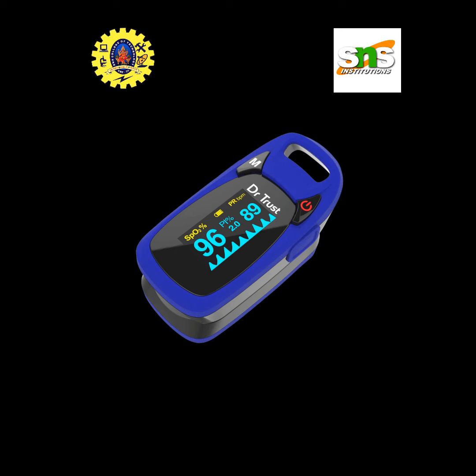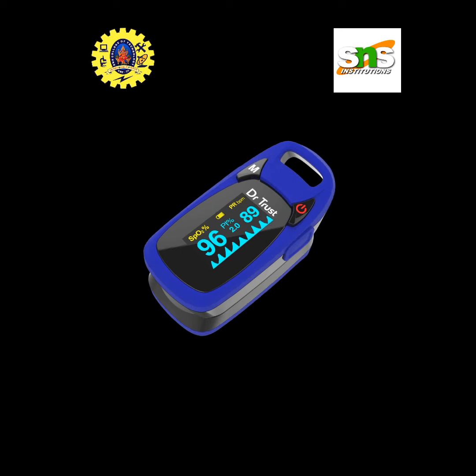Now, the pulse oximeter emits two types of light. One is red, which has a wavelength of approximately 650 nanometers, and the other is infrared light, which has a wavelength of 950 nanometers. The pulse oximeter works out the oxygen saturation by comparing how much red light and infrared light is absorbed by the blood.